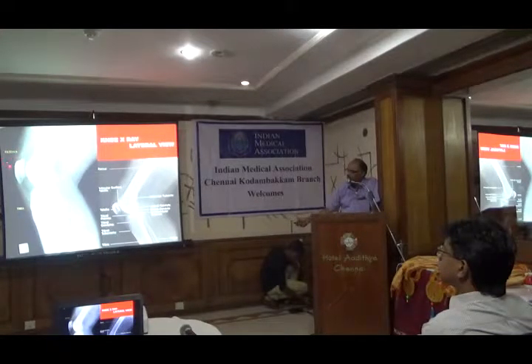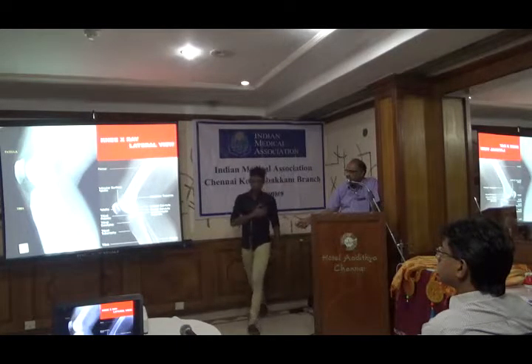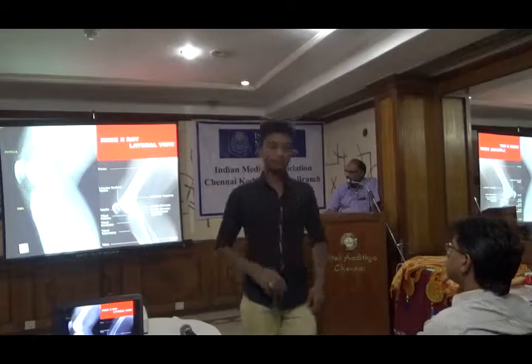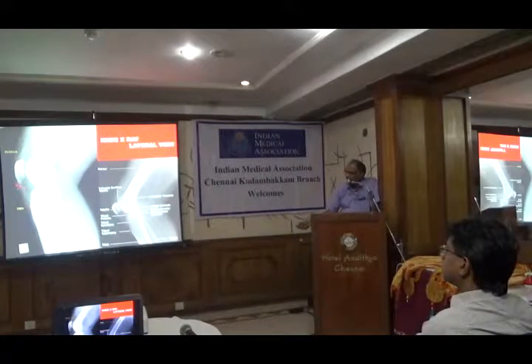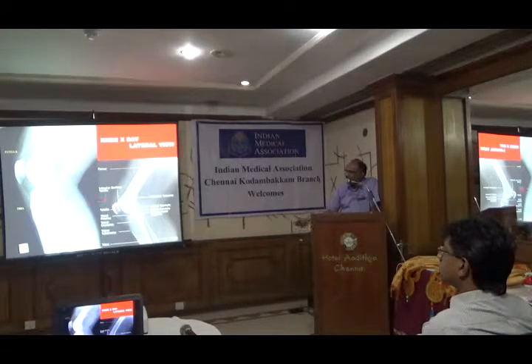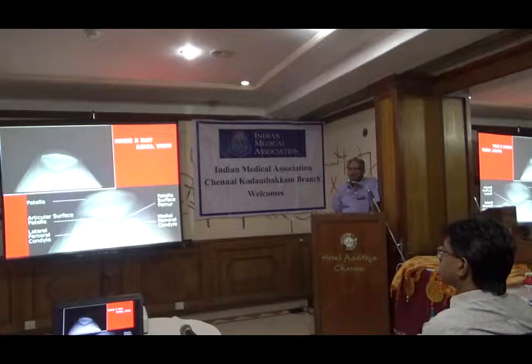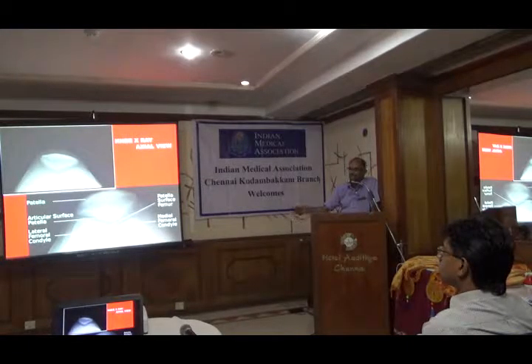Usually whenever an X-ray is taken, the medical teaching is to take a lateral view also. In the lateral view, you look for soft tissue — this is the patella, the patellofemoral joint space, the lower end of the femur, and the upper end of the tibia. This is the normal infrapatellar region, and you can see that the fat planes are very clearly seen here, and this is the fibula.